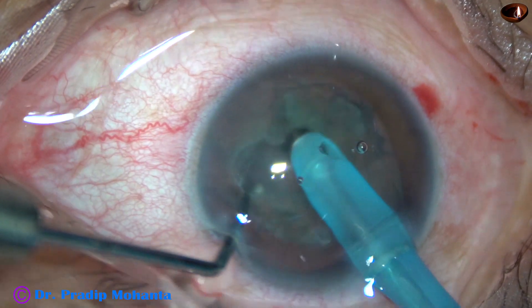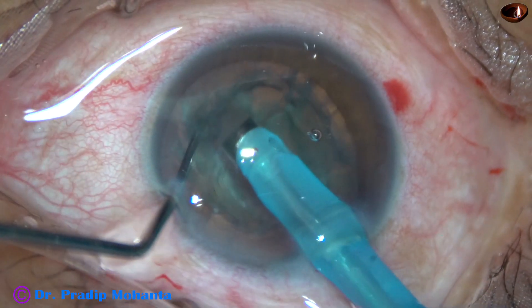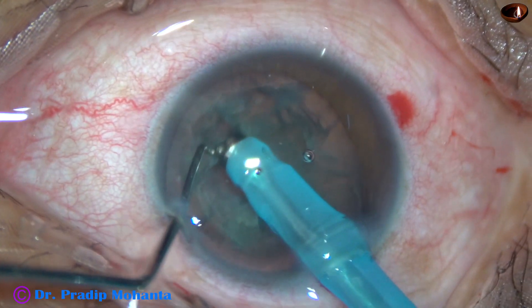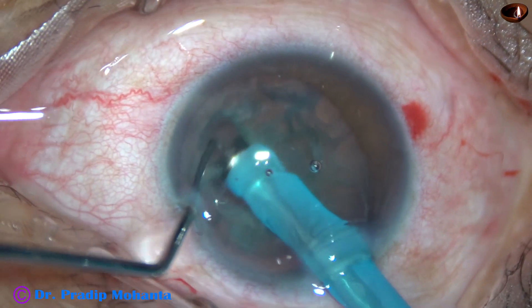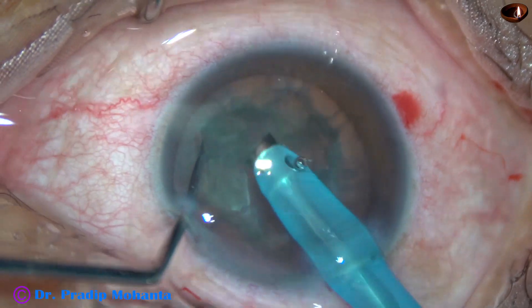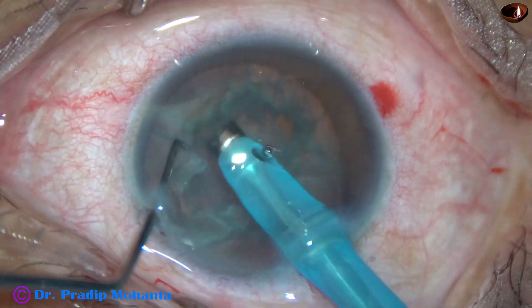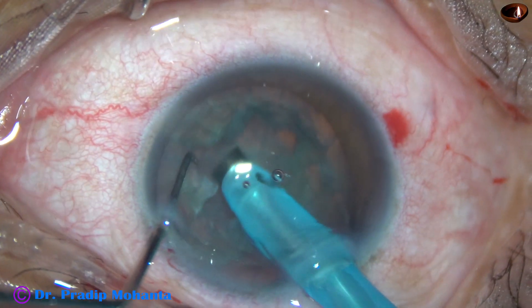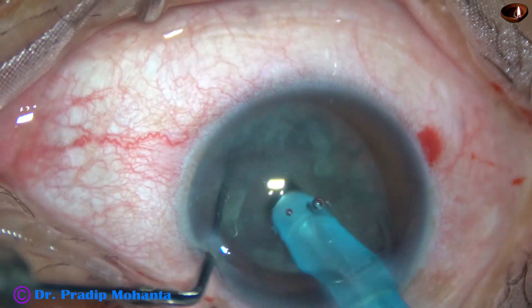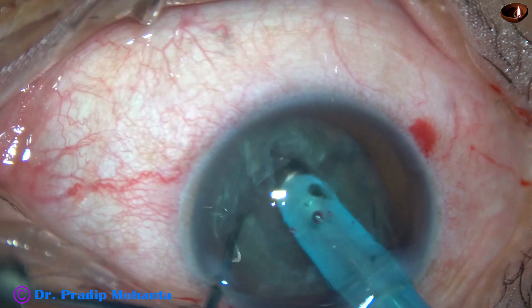At this stage I thought it was okay, but this was only a very small crack. The nucleus didn't divide into two hemi-nuclei. I then made a trench on the hemi-nucleus and tried to divide it, but I had difficulty judging the depth because the anterior chamber was already very deep. I made the central part deeper and tried to crack the nucleus, but it didn't work.